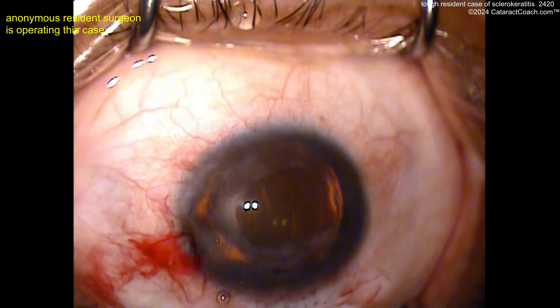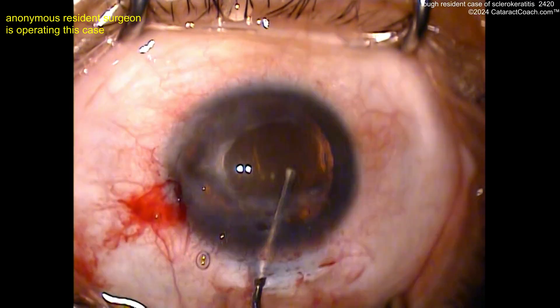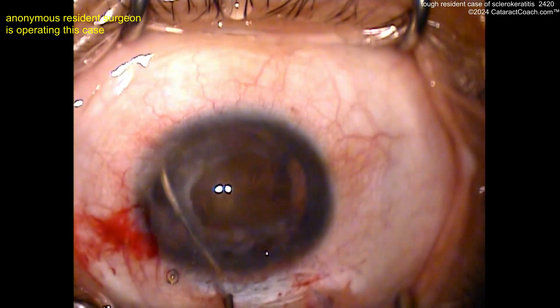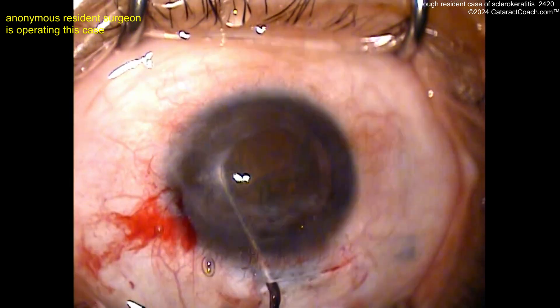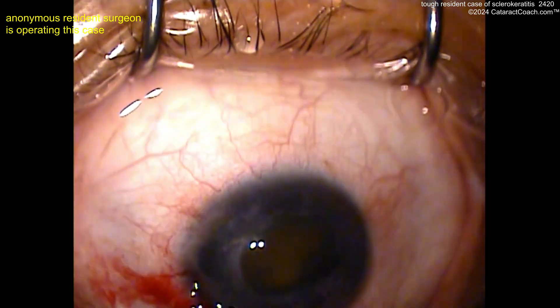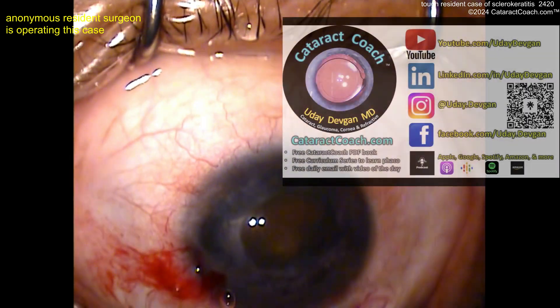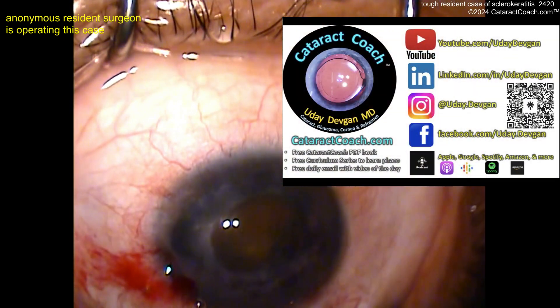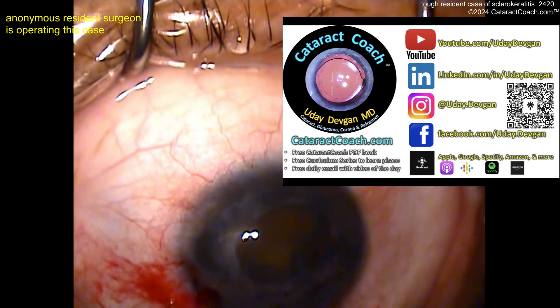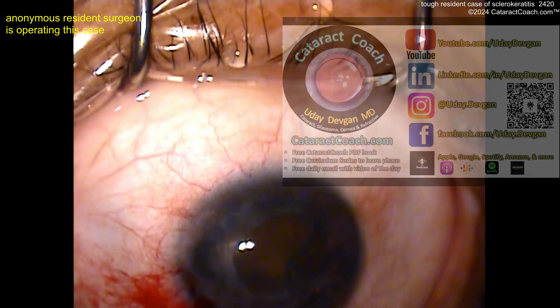Now let's see the technique. With this cornea blocking the view, my preferred technique here would be to prolapse it out of the bag and do a tilt and chop or something similar. Let's see — the hydrodissection looks okay. Wish the eye was in primary gaze — that's the patient's fault. But hey, if you're a resident, I've got great materials for you on cataractcoach.com — a free book, it's a PDF file, just download it for free.